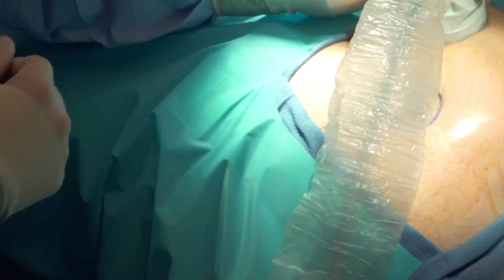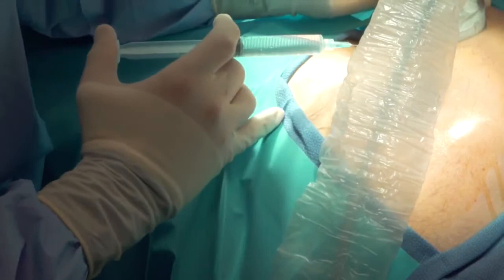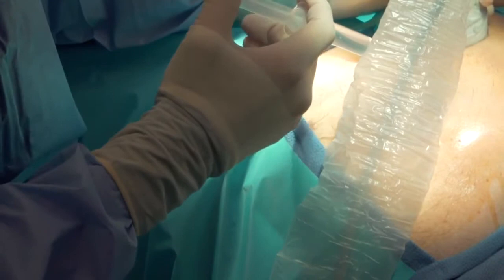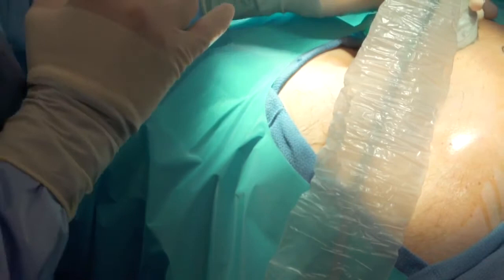So if I could have, so I'm using 2% lidocaine with epi. Hey man, you're going to feel a little pinch, okay? So what I'm going to do is I'm going to try to localize the superficial skin here, and I'm going to localize down, being real careful not to anesthetize down to the nerve itself, because we will have to stimulate. If we do end up anesthetizing the nerve, we will not be able to stimulate.